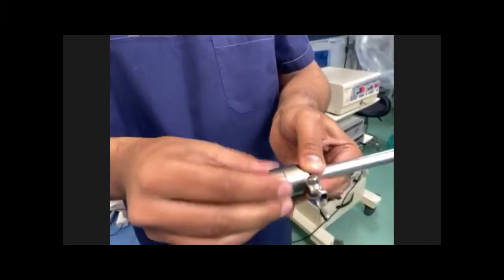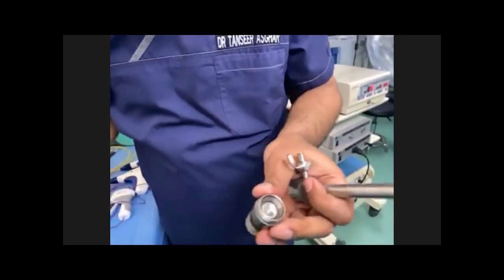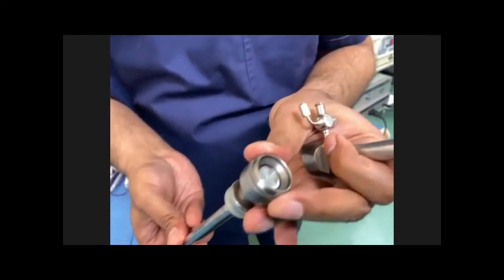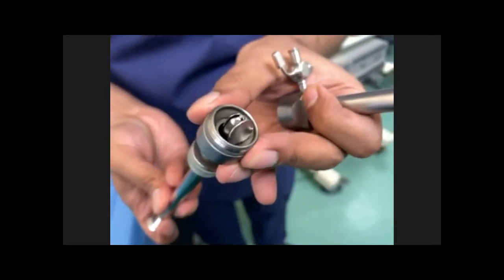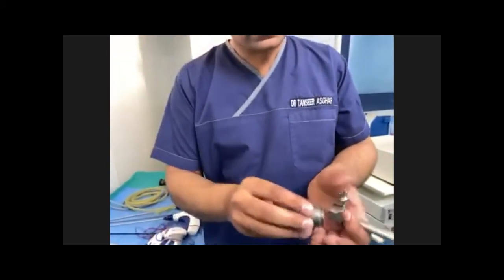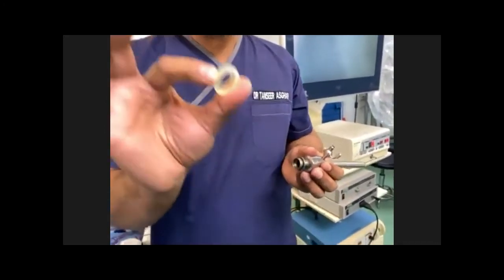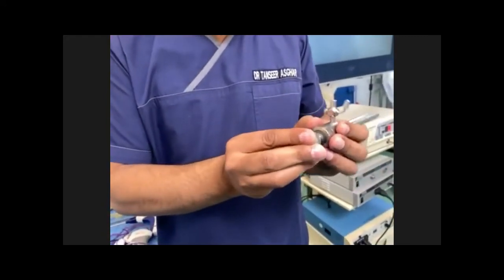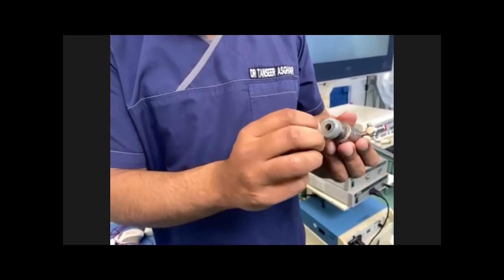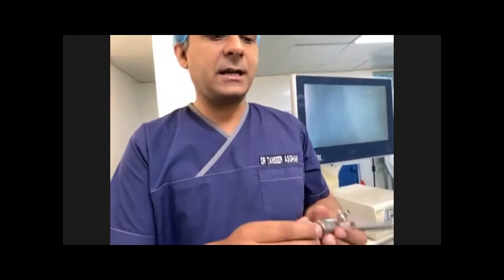Then if you open this trocar, you can see a safety valve over here as well. This is a valve which should be working well, so when you start the procedure, it doesn't leak. Okay? Like this. Then there is a plastic type of sleeve over here, which should be very good. It should not be cut, it should not be torn, because if there is low pressure in the abdomen, it will be very difficult to operate.